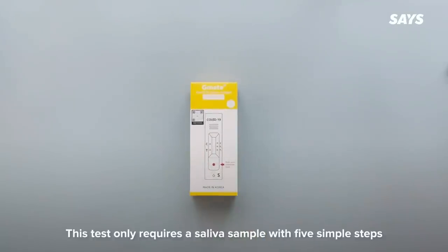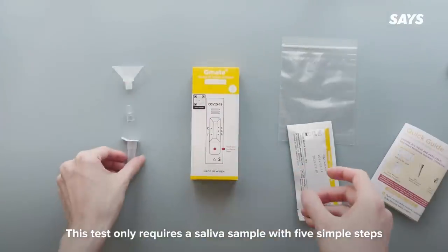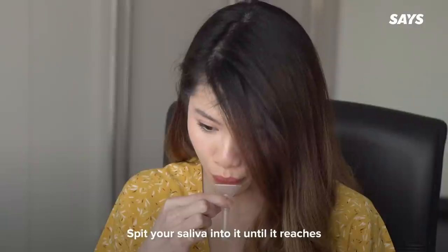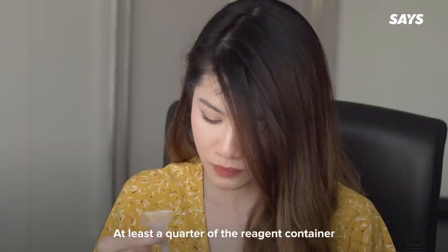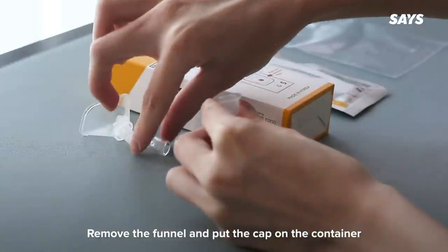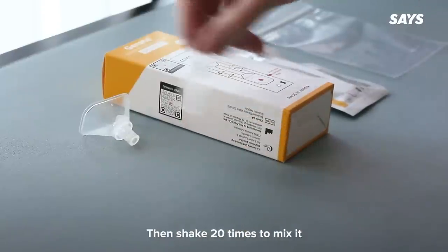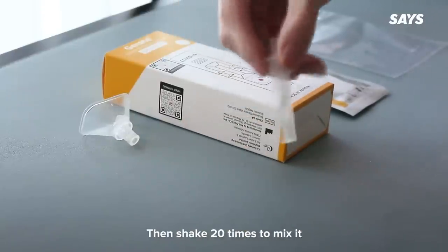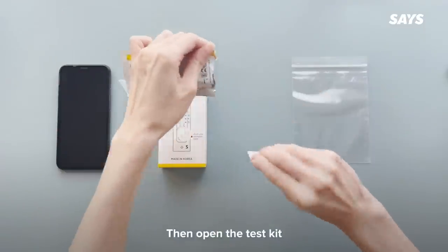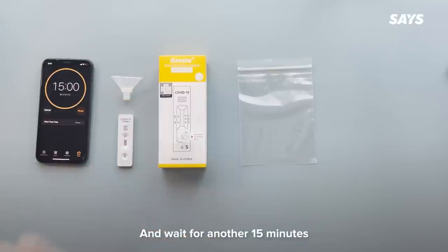Next, the G-Mate. This test only requires a saliva sample with five simple steps. Step one: tear off the seal and connect the funnel to the reagent container. Squeeze the bottom pier 20 times, then shake 20 times to mix it. Once done, leave the container for five minutes. Then open the test kit and drop four drops of your mixed reagent onto the test kit and wait for another 15 minutes.